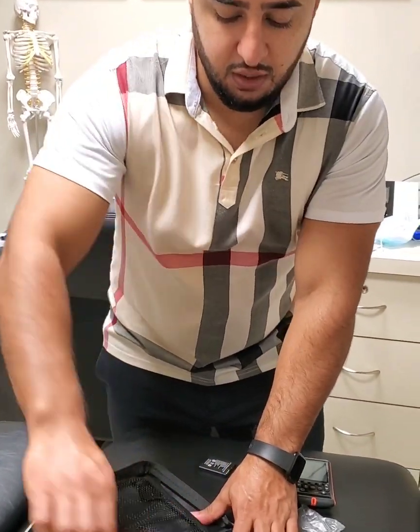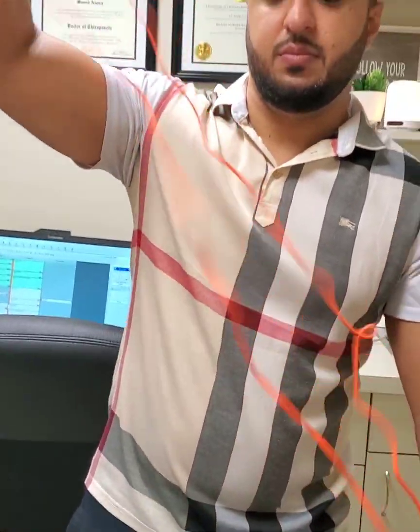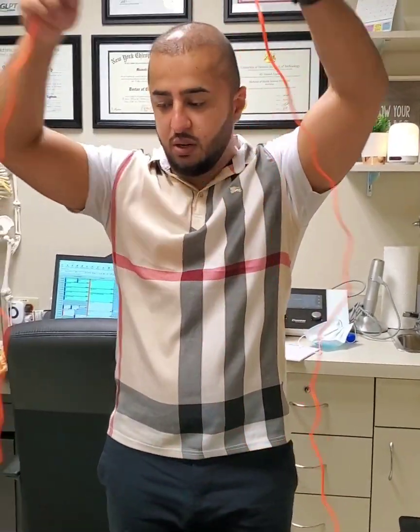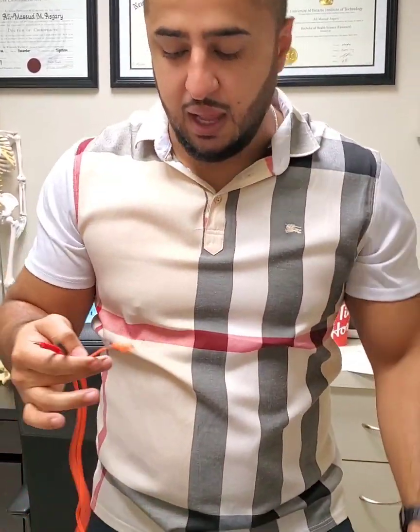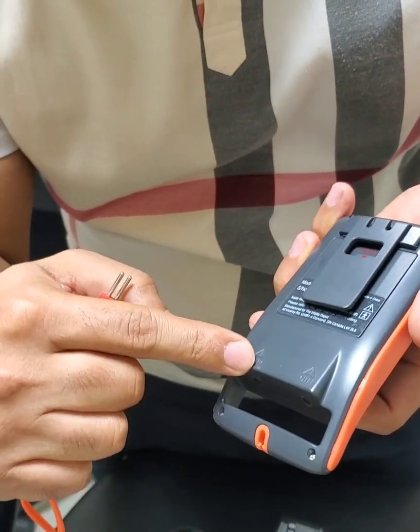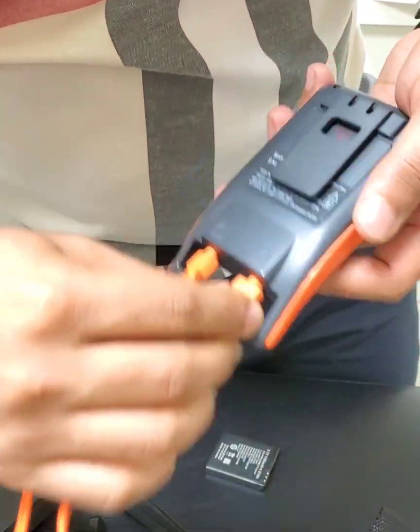It should also be coming with two electrodes — the wires. There should be two of them in here, one here and one here, and each one of them are identical to each other. They have a red and a black, and these will be going inside the bottom part of the machine. There's a channel 2 and a channel 1, and you're just going to be plugging them in right here like that.